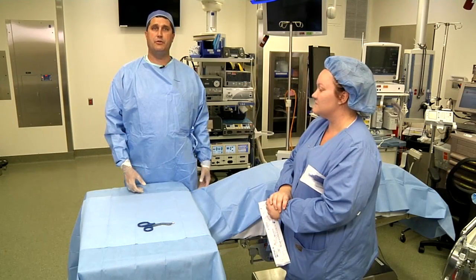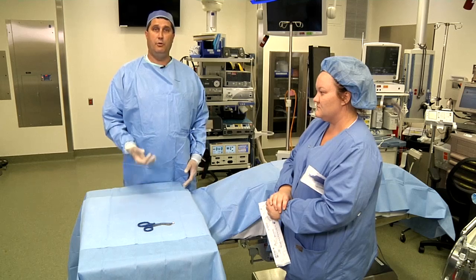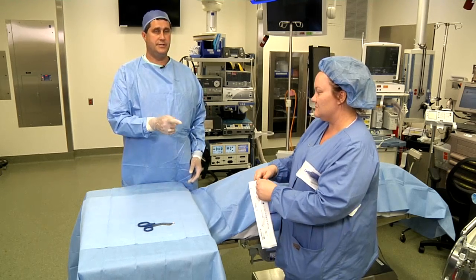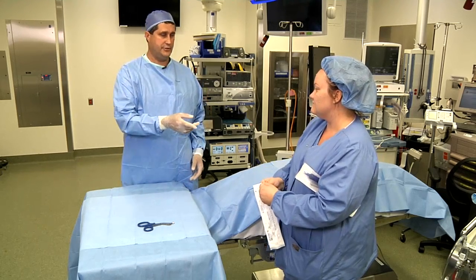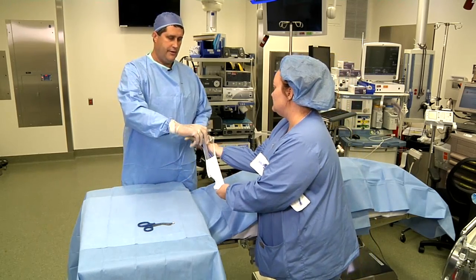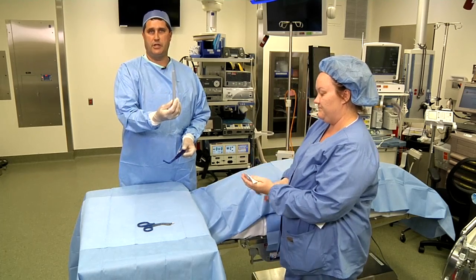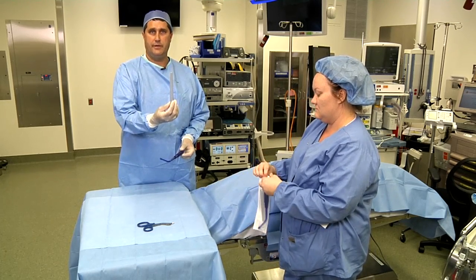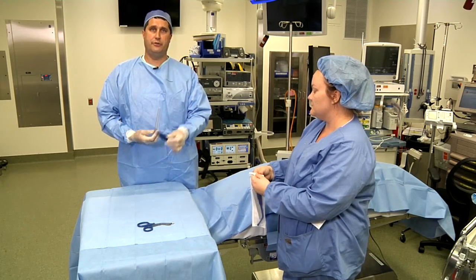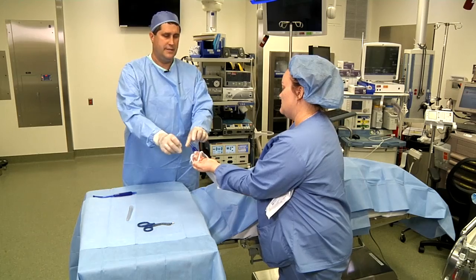The next step is to have the sterile components pulled up onto the field. We'll open up the sterile components, which consist of the Viaguard suction strainers, and there's two. Importantly, this is the piece we'll utilize for the case. The other can be reserved for use later — we do not use that as part of the HT-2000 setup.